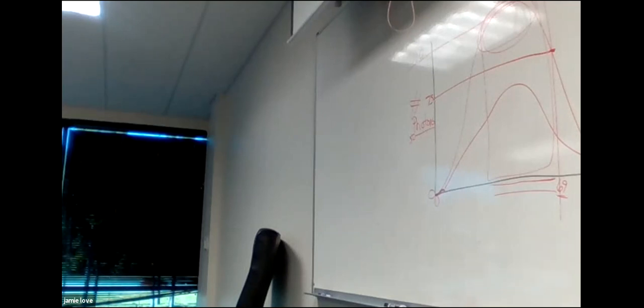I don't think they're on the registry. I have to double check the registry list again. But emission spectrums, if you do need to read them, that's what they're wanting you to interpret from them. Changing kVp, what does it do? Increases the number of photons, increases the energy. Both of those move over. The quality and quantity. So the last table kind of puts it all together. Generator type is something we aren't looking at right now. That'll be in your next physics class.